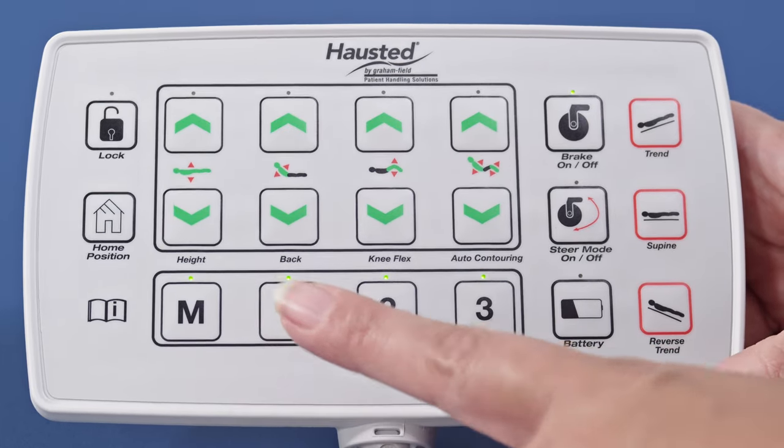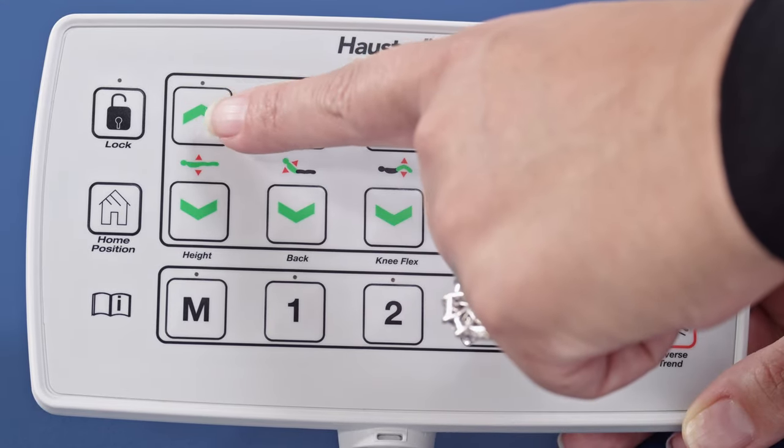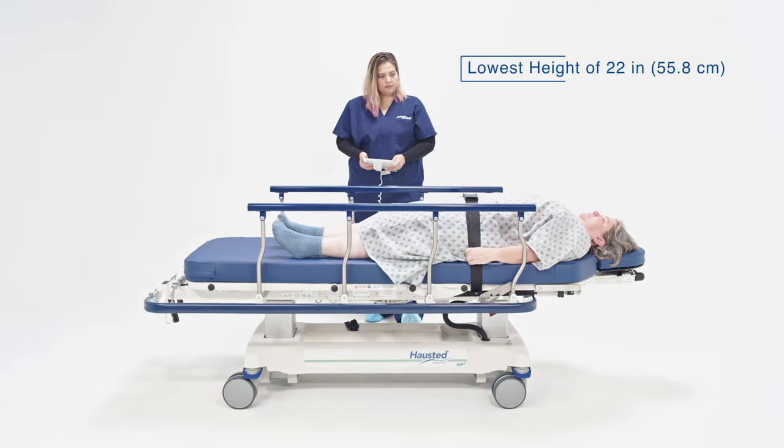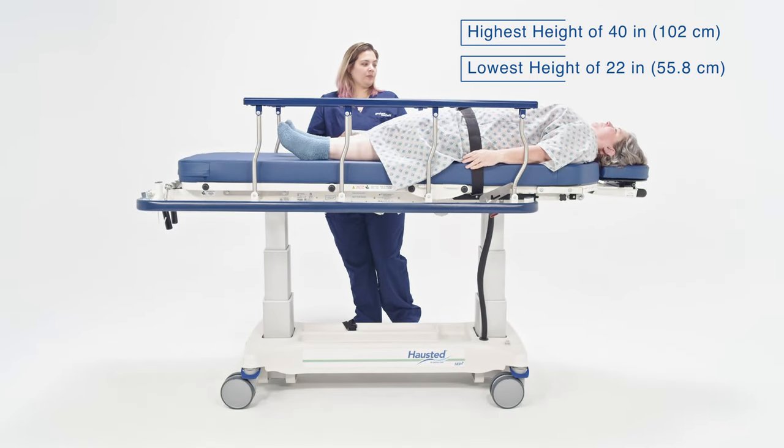To reduce positioning time, the pendant comes with three memory presets. The height can be adjusted from a low of 22 inches, or 55.8 centimeters, to a high of 40 inches, or 102 centimeters.